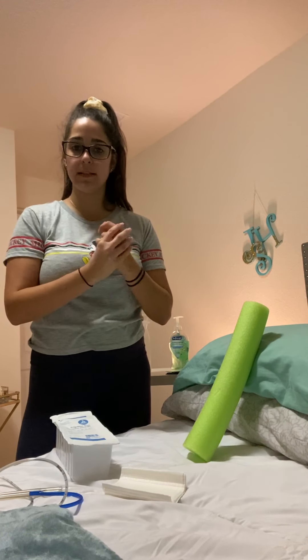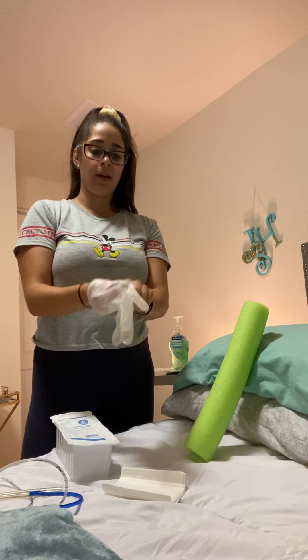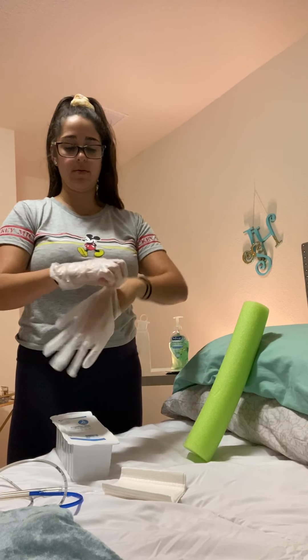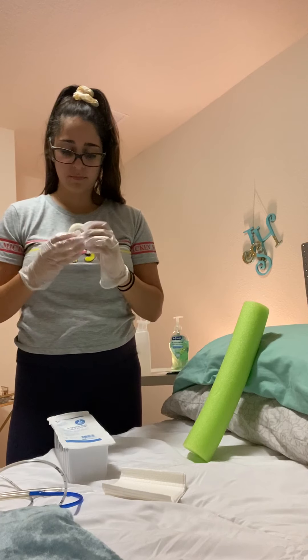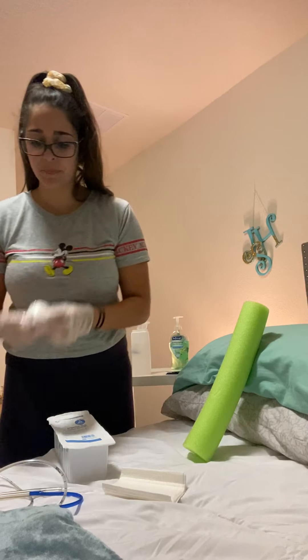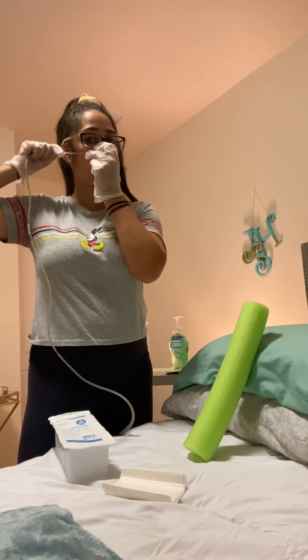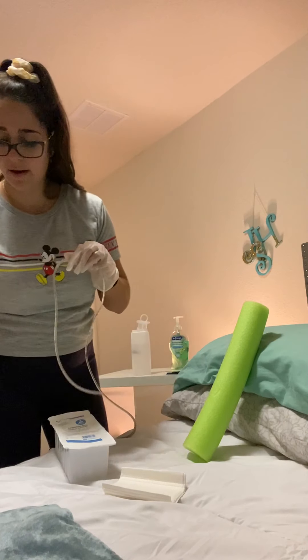Next I'm going to wash my hands, perform hand hygiene, and put on a clean set of gloves. Then I'm going to get my tube and some tape. I'm going to measure the tube on my patient starting from the tip of the nose to the ear, then down to the xiphoid process of their sternum, and I'm going to mark that with tape.